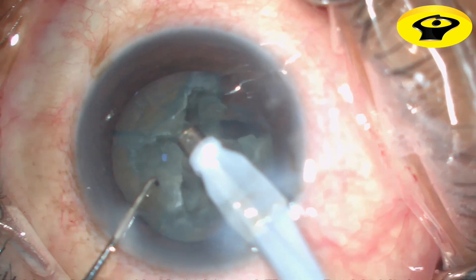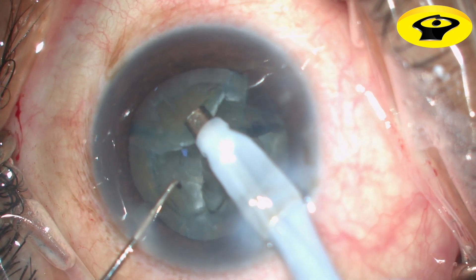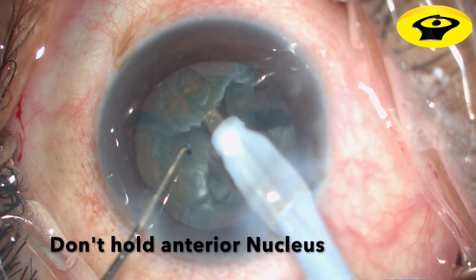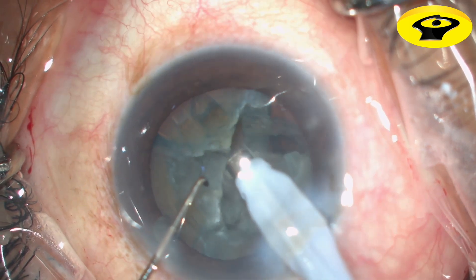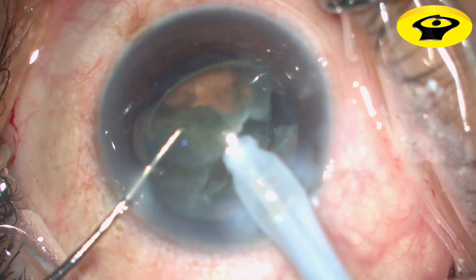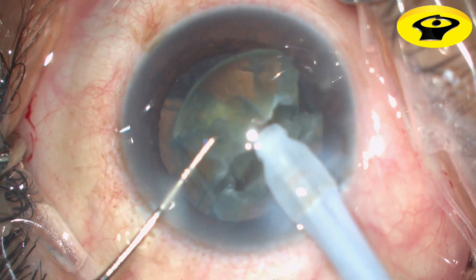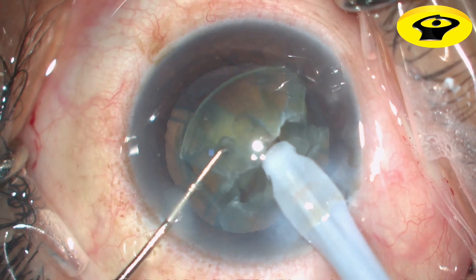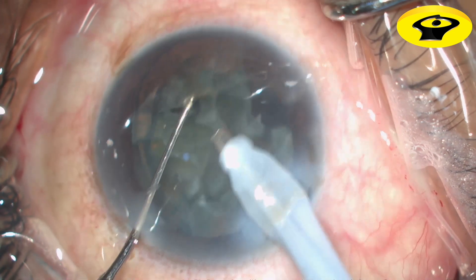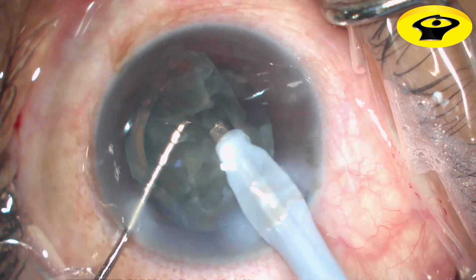Rotate the nucleus in whichever direction is comfortable and go for the next quadrant. Don't go to emulsify deep into the nucleus or too superficially, as the hold on the nuclear quadrant will be lost. Wait for the vacuum to build up and then use phaco energy for the nucleus to come into your probe. Use the second instrument to bring the fragmented nucleus towards the phaco probe instead of going searching and running behind the nucleus.